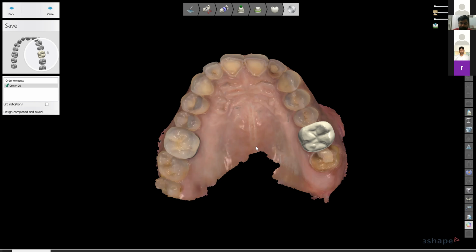Yes, we can design. Here the advantage is that everything is in the library, so you don't have to actually build around it. But yes, one who is experienced in designing can use free-form and make their own library. They can design it in any way. They are not bound to purchase those softwares for dental crowns and bridges or abutments. If we can do it on our maxillofacial softwares, we can do it anywhere.